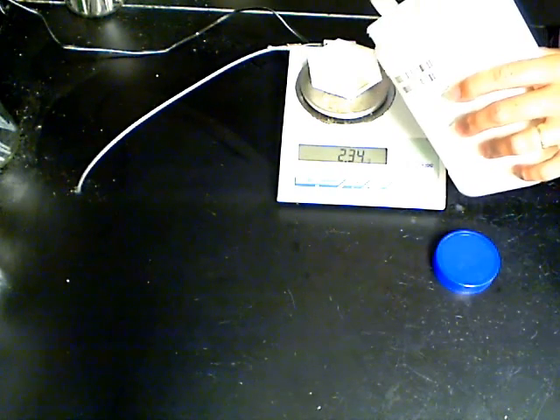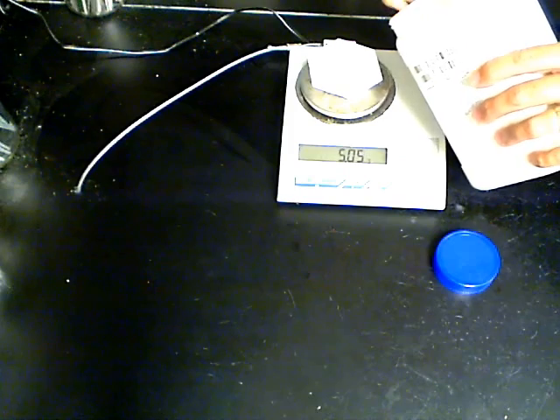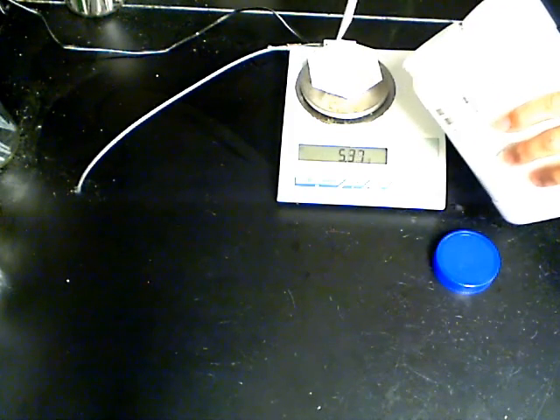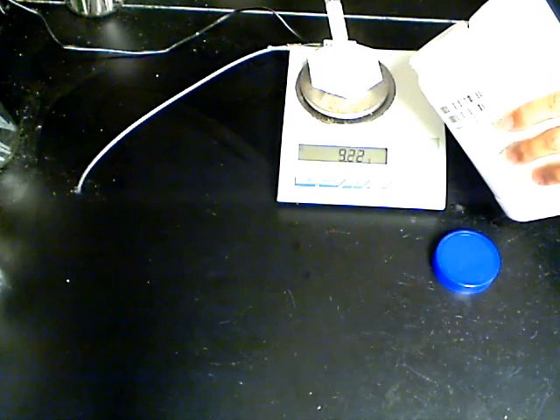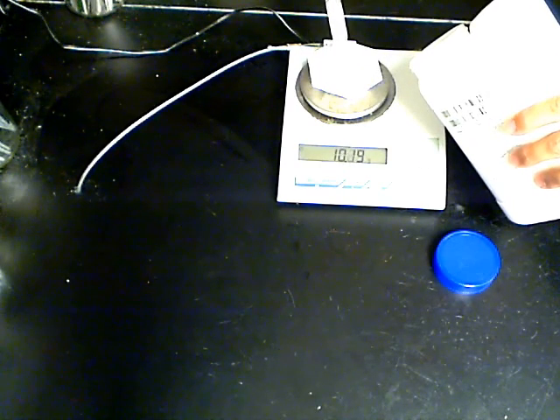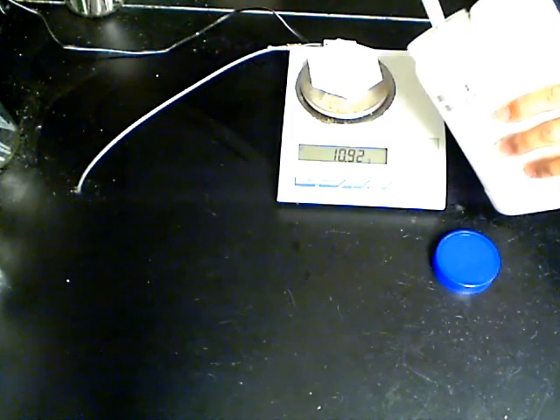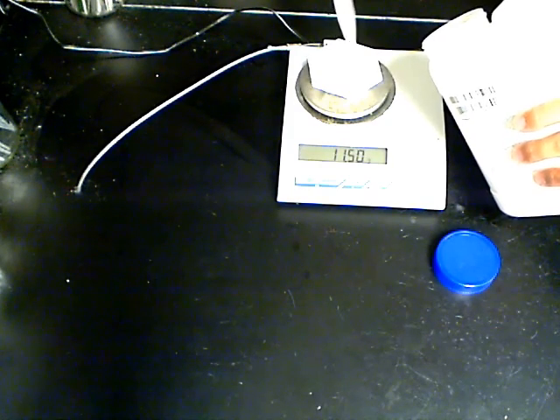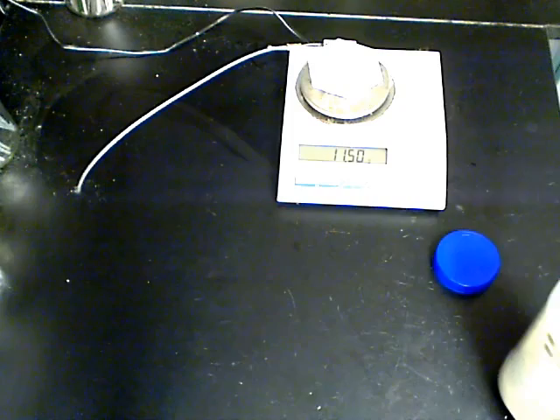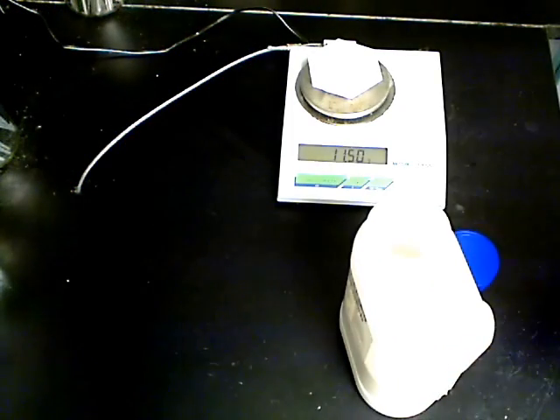The balance need not display exactly 11.50 grams, but somewhere in the neighborhood of 11.46 to 11.54 will be acceptable. Carefully add a small amount of powder at a time, especially as you begin to reach the end point. When you have reached the desired amount, replace the lid on the container and set aside the measured powder until the next step.